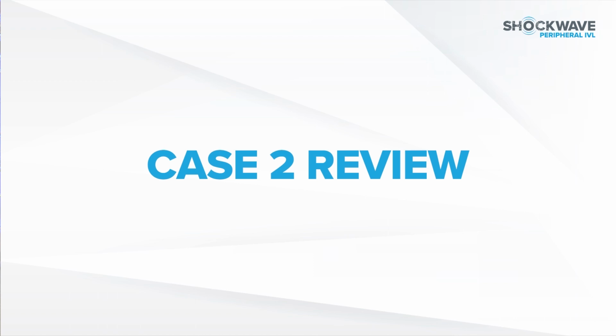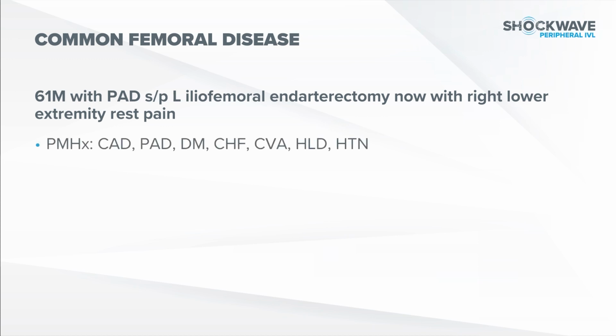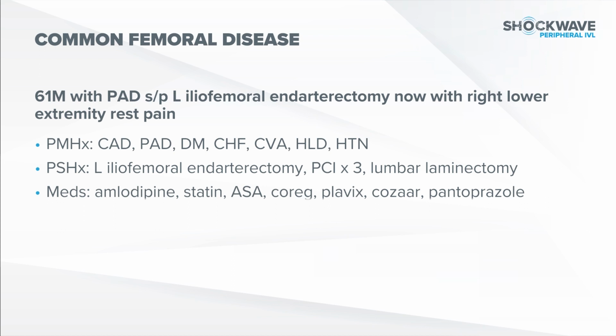Yeah, great comment. So this is another case in a different location where we use a shockwave technology, and I've got close to 10 patients who are their own control. So this is a 61-year-old man who I had previously done a left iliofemoral endarterectomy, who presented back to clinic 6 months later with right lower extremity rest pain.